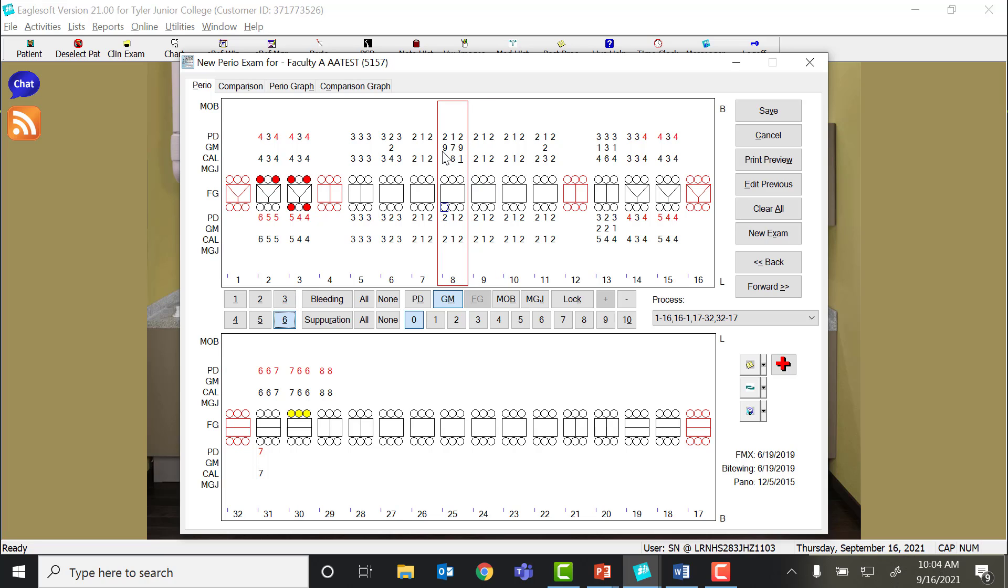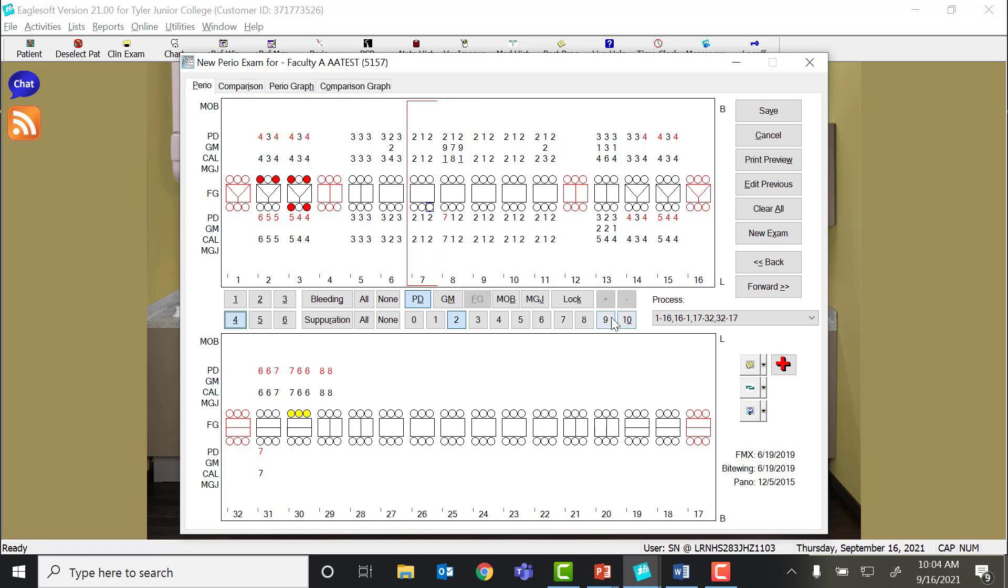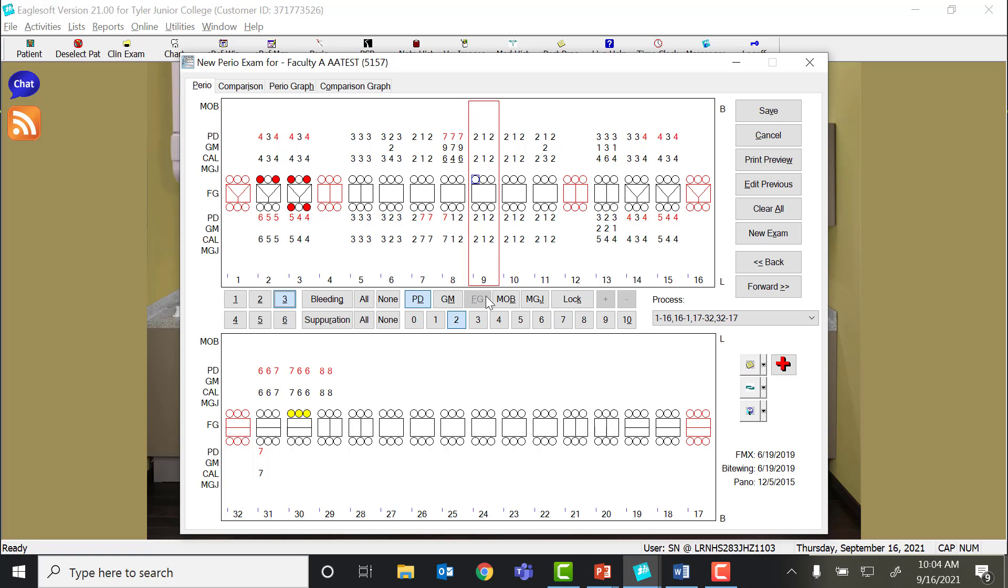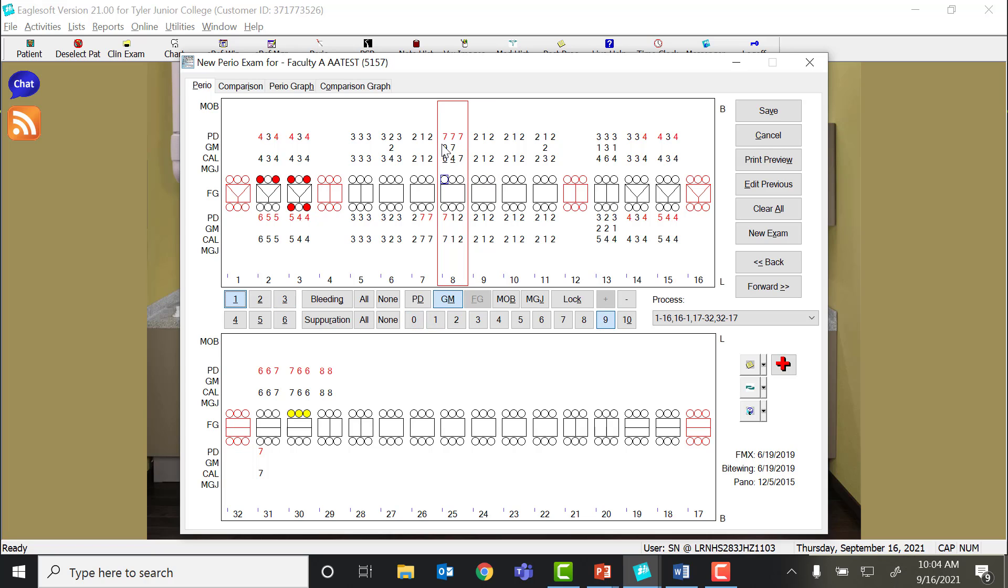But we know that that's not actually the probe depth. We're going to say we have 7, 7, 7 probe depth on the facial of 8. But this patient has gingival enlargement.